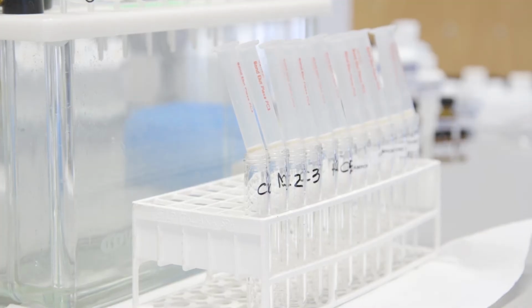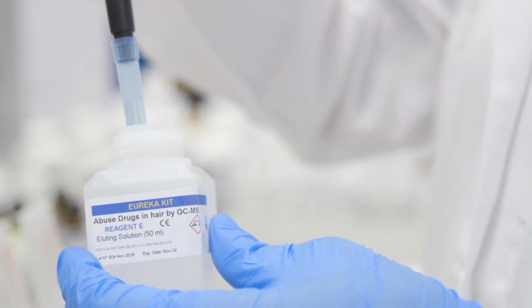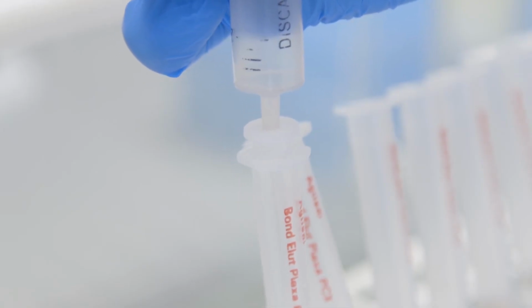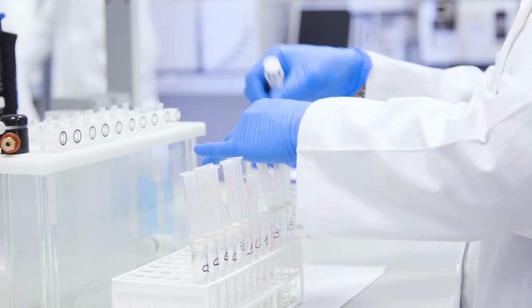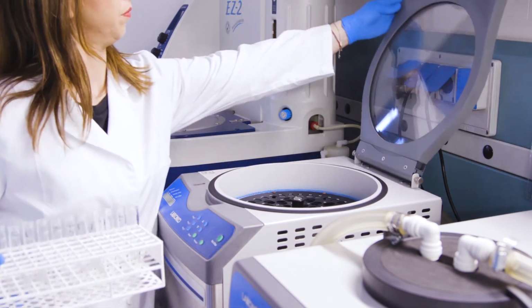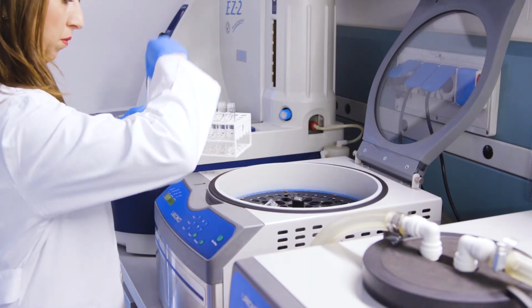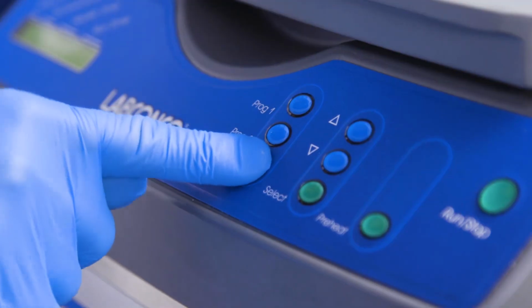If you're looking for basic drugs of abuse, proceed with elution by adding 1 ml of reagent E, eluting solution. Even in this step, dry the column with a gentle airflow. Collect the eluate in Pyrex glass test tubes and vortex. The eluate should be dried with the help of a stream of helium or nitrogen, making sure that the temperature remains below 40 degrees Celsius, or with an evaporator or concentrator.